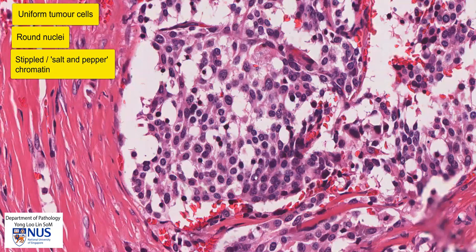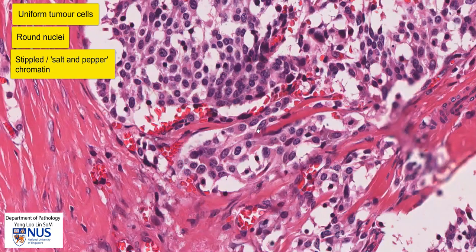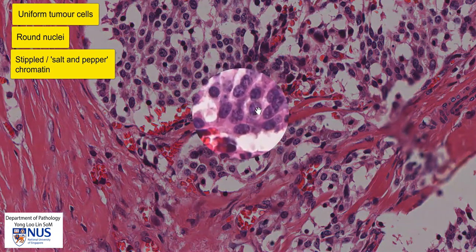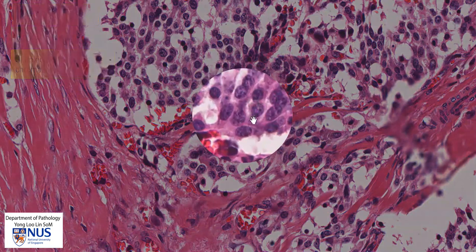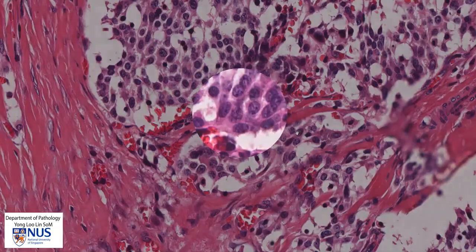The pepper represents the coarser granules and the salt represents the finer granules. We can appreciate this granular appearance very nicely here, and this is the classical appearance of neuroendocrine tumors.